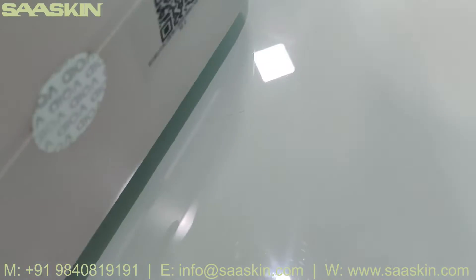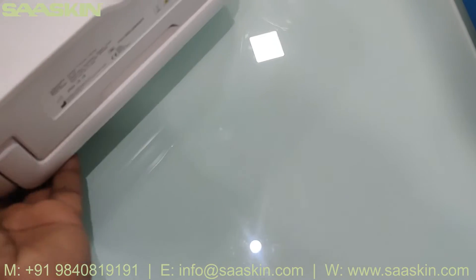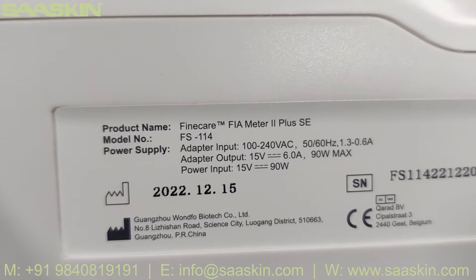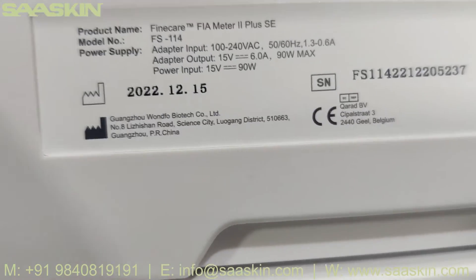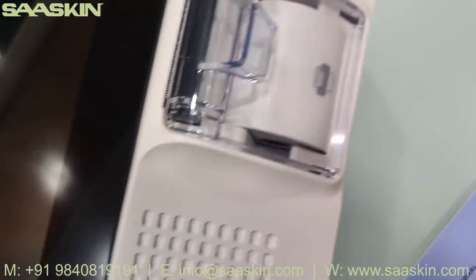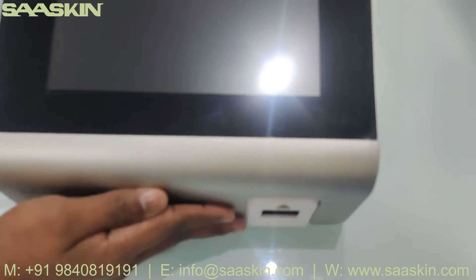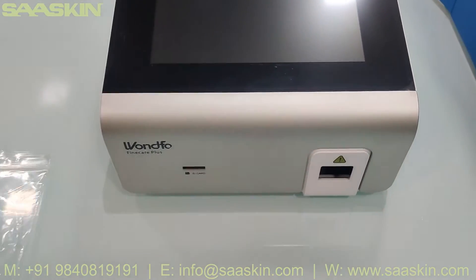Here's the power cord position. On the other side you can see this is Unfo FineCare. It has a serial number and the product name is Unfo FIA Meter 2 Plus SE. The model number is FS114. I have the SE certified version. Manufacturing location is given. This is how the printer works, where you load the printer to get the printed output.